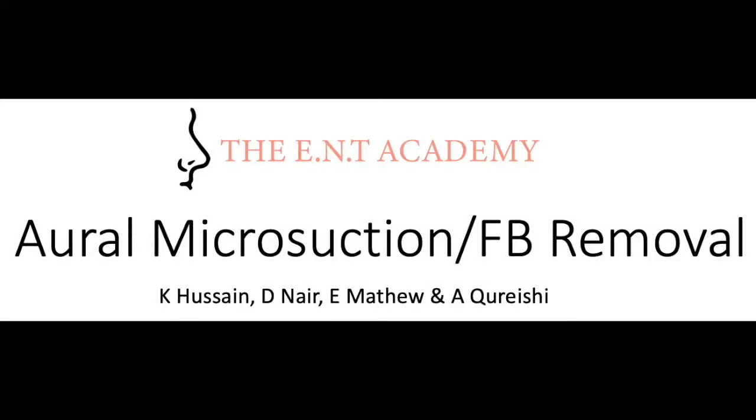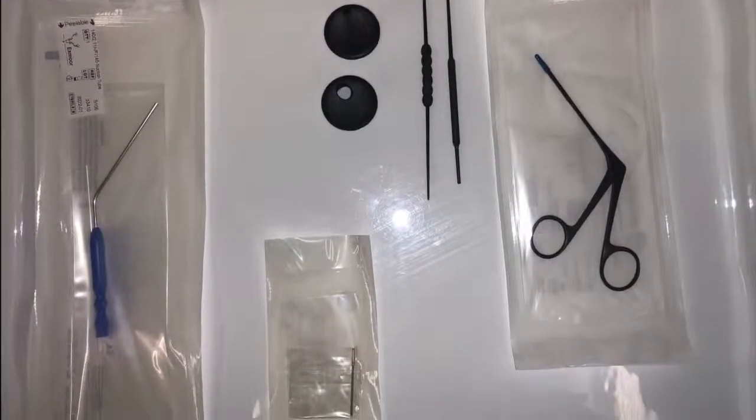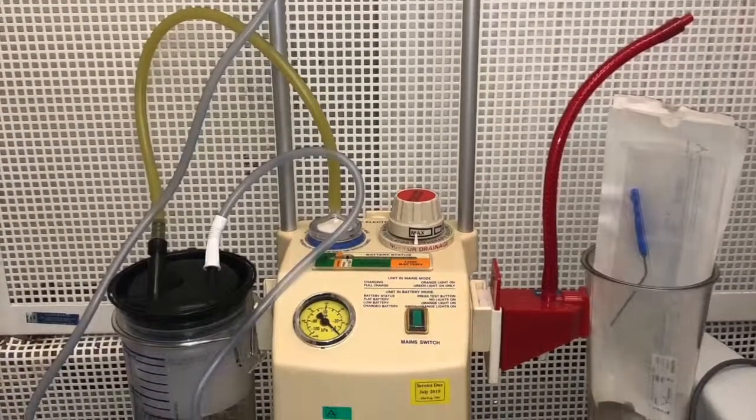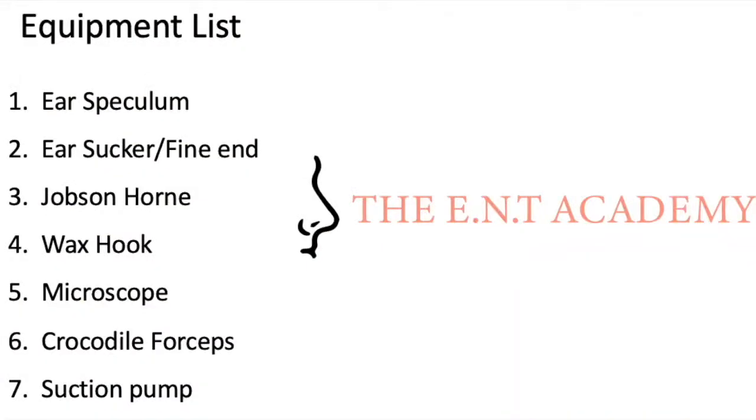Welcome to our instructional video on aural microsuction and foreign body removal. This is the equipment you will need, including suction with a vacuum, a microscope, and the equipment list as demonstrated.